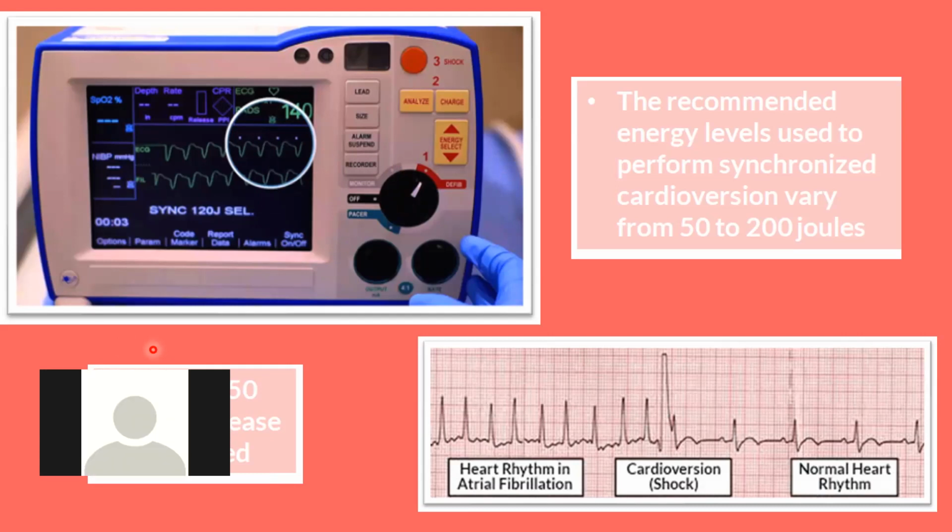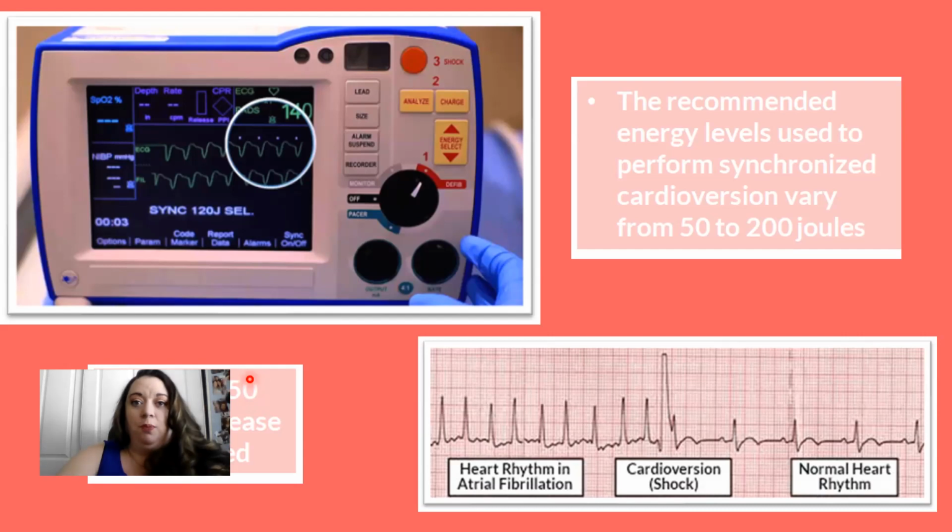If you shock during, I think, the T wave, don't they flatline? Yeah, if that shock lands right on top of my patient's T wave in their cardiac cycle, it can throw them into cardiac arrest. At some point they figured this out, and we stopped trying to time it. Because if I have a heart rate of 180, I don't want to try to time that shock at all. So that's why these machines are made like that.